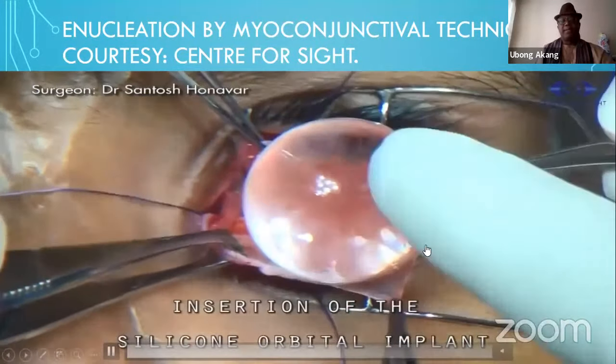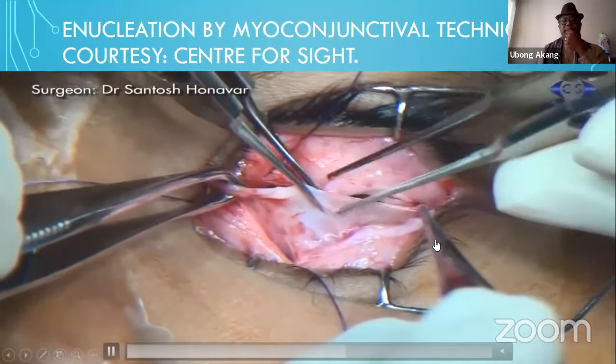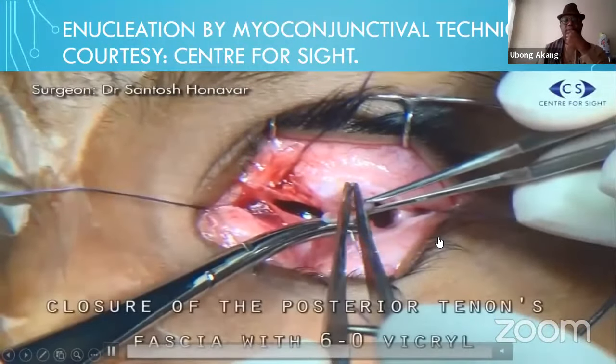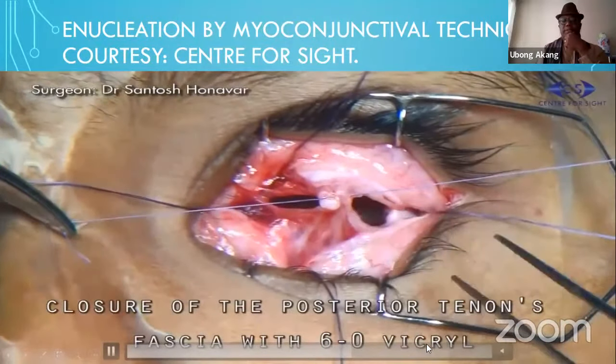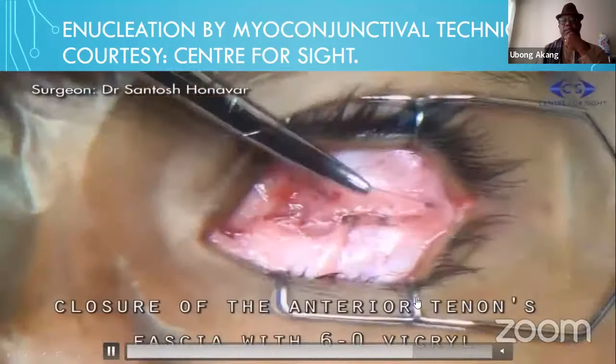You now put your implant posterior to your posterior Tenon's. You now close the posterior Tenon's with interrupted stitches, and then you close the conjunctiva.